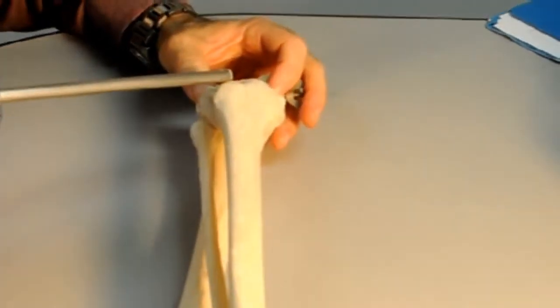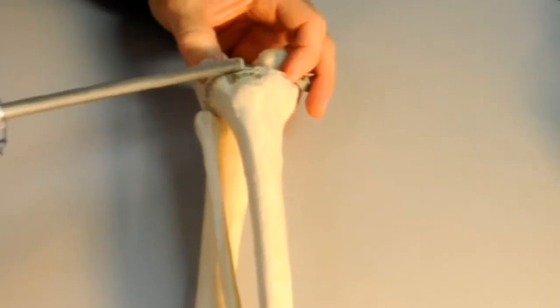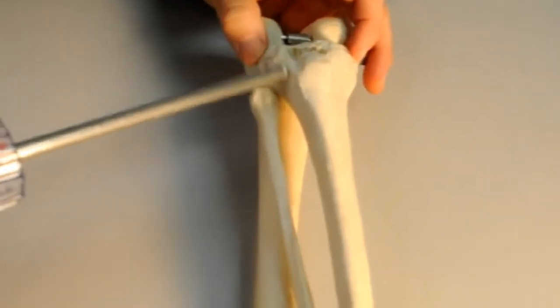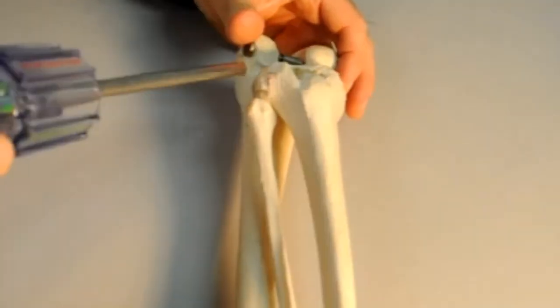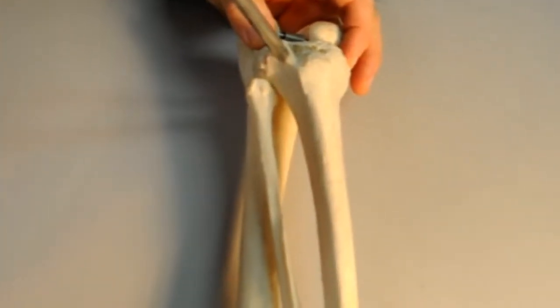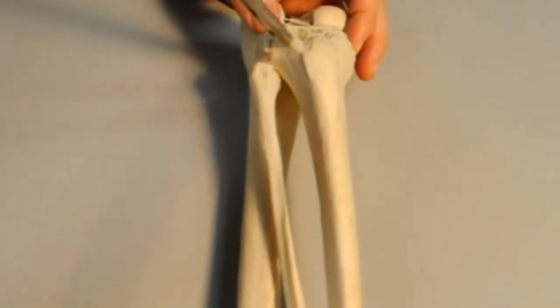The tibial tubercle is at least one and a half centimeters to two centimeters below the tibial plateau even in this very small anatomical example. The harvester is introduced being aware of the joint line level and one wants to stay about a centimeter to a centimeter and a half away from the joint line in introducing the harvester.